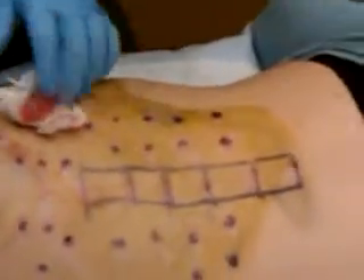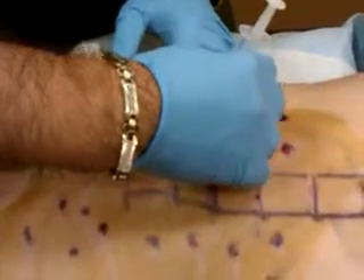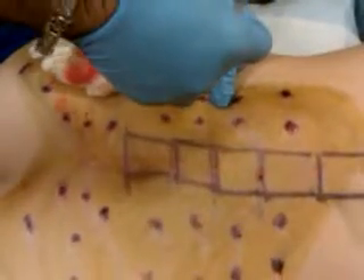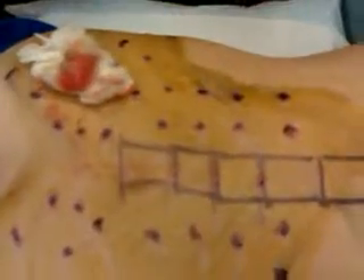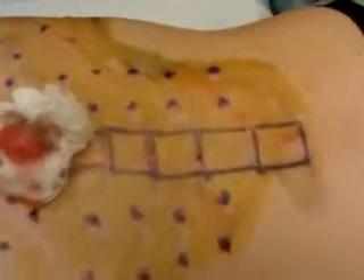Okay, that's L4 — I feel the L4. I press the tissue so I can hit the crest. Now I hit the crest, now I'm going to walk the needle and go in. You can see the needle goes right in — four inches deep, that's how deep the lumbar is. That one feels not too bad. The right side is more degenerate, so most of the problem is on the right side. The left side looks pretty nice, but it's been affected by ligament issues.